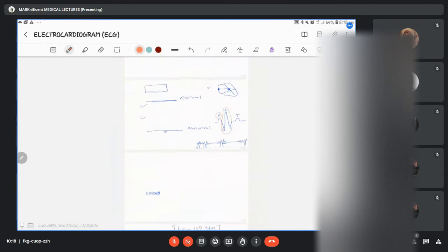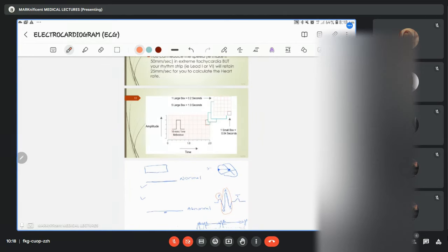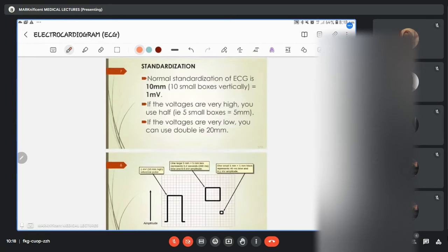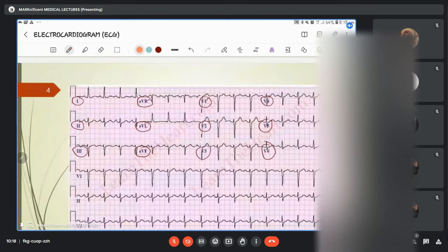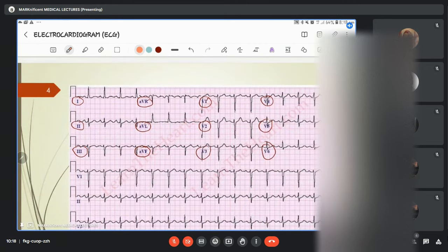So quickly about those V1, V2, V3 you're talking about there. So when you pick your ECG graph, this is what you look at. You have 1, 2, 3, you have AVR, AVL, AVF, you have V1, V2. So it is suggestive. You always make reference to this V1.